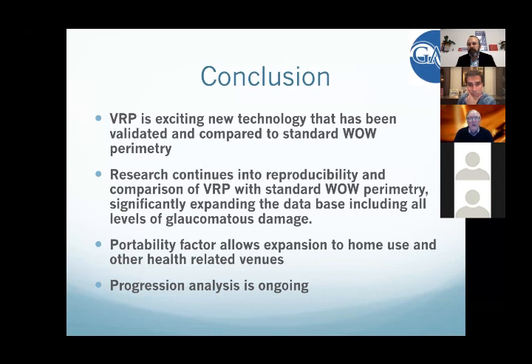And I'll tell you, I talked to my technician who does the fields. I went over and did one a couple of days ago, just to do the test again. It's always good to know what our patients go through. And it was amazingly efficient. It was fast. I could just wear my glasses. Sometimes they'll put a little defogging solution on the lenses, and I think that helps.